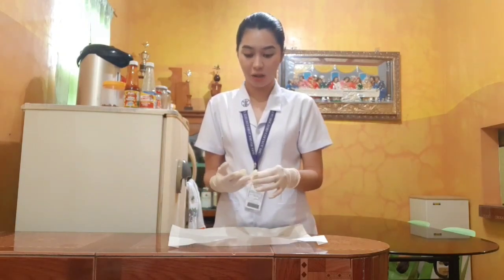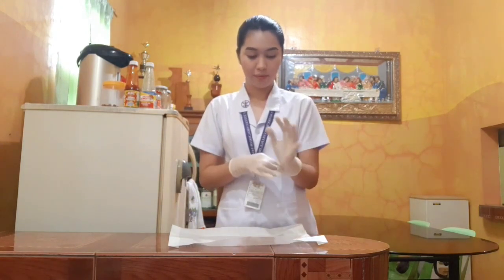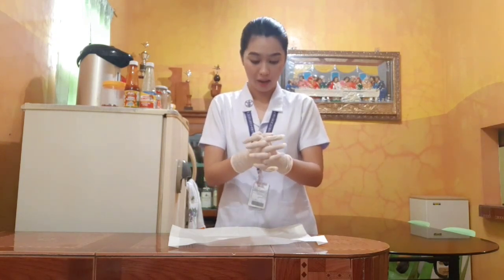Okay, now that both of my hands are gloved, I can adjust each glove so that it fits smoothly. Okay, now that the gloves are all good, we can now interlock the gloved hands like this, keeping them at least 6 inches away from my clothing, and keeping the hands above waist level and below the shoulders. This prevents accidental touching of any non-sterile objects and of my uniform.